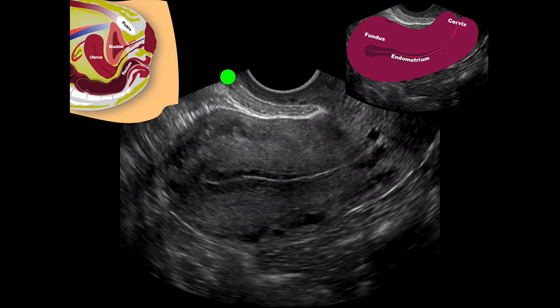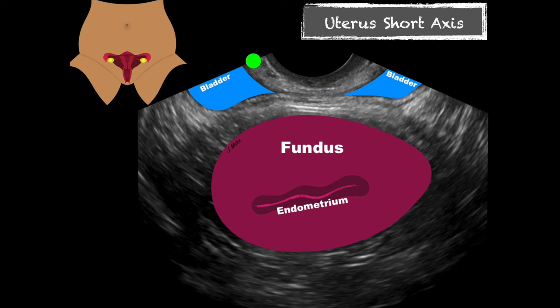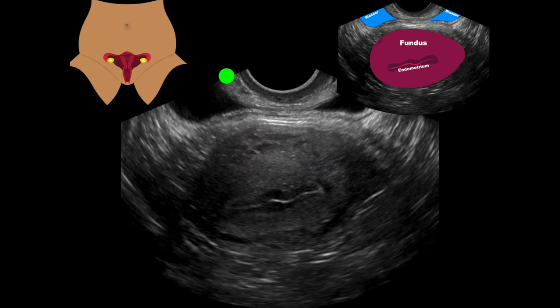We'd want to see it right down along that endometrial stripe — in the fundus, right in that endometrium. Those are typical spots. If it's getting too located to one side, you've got to worry about interstitial pregnancies. It used to be said that less than 5 millimeters of surrounding wall was concerning, but that's been questioned. Make sure you're right along that endometrium, and if you're not certain, you can still ask for a consultative ultrasound.